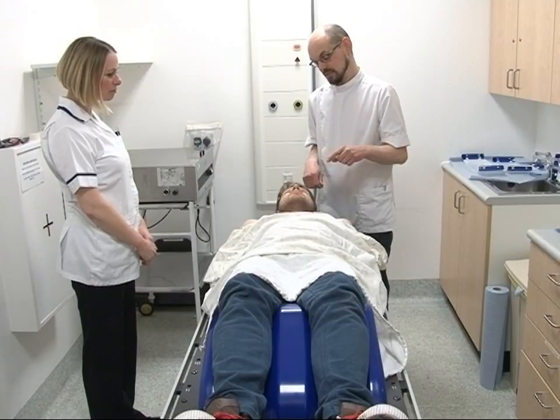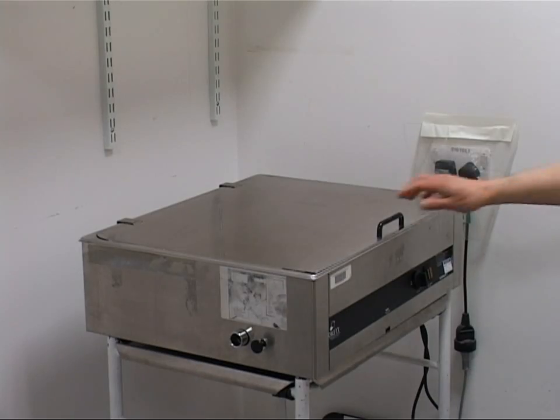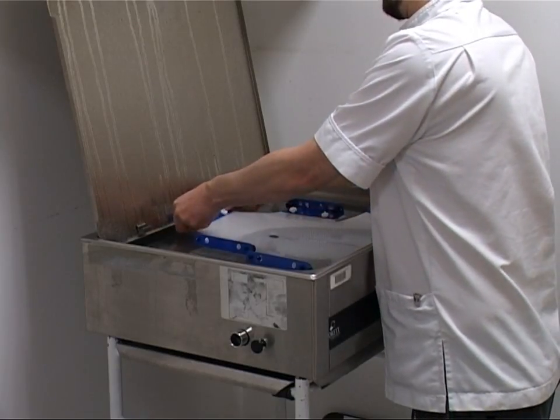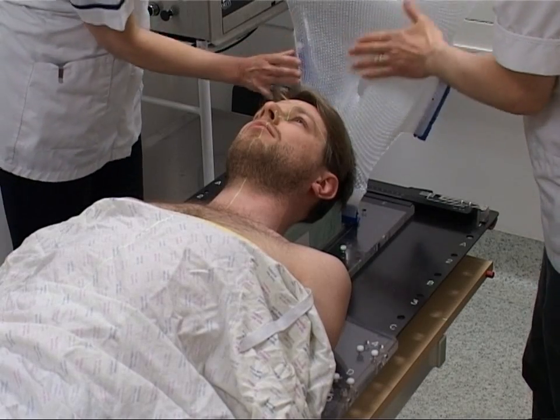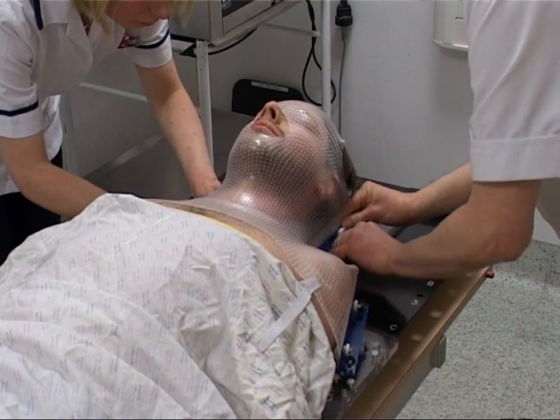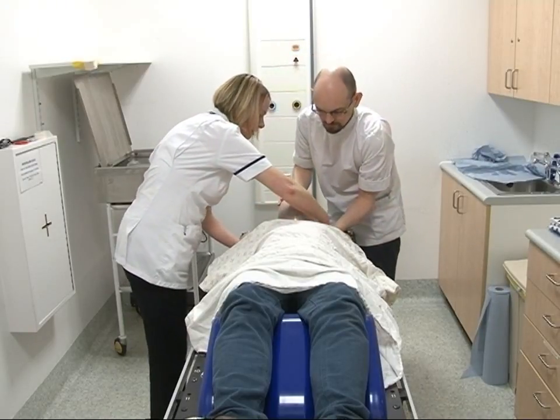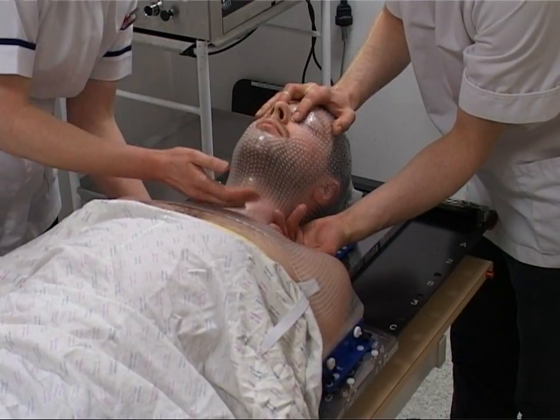Most masks are made from a thermoplastic material, though sometimes other materials are more suitable. The thermoplastic material is softened in warm water and then placed carefully over your head and neck. The technician will smooth it into place whilst making sure you stay in the correct position for treatment. This is often described as similar to having a facial, as the mask will feel warm and damp.